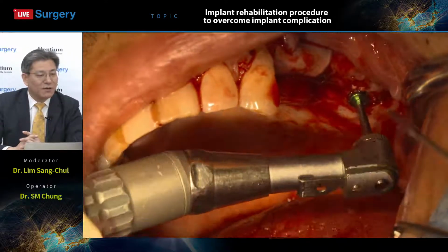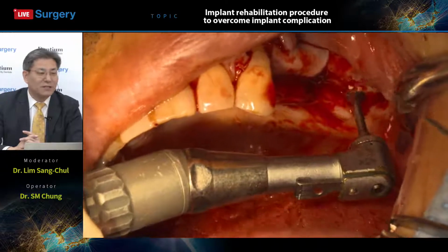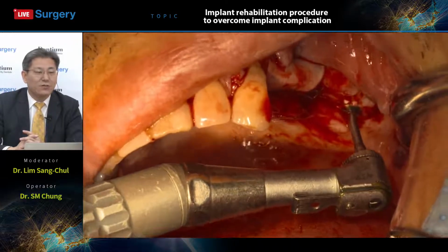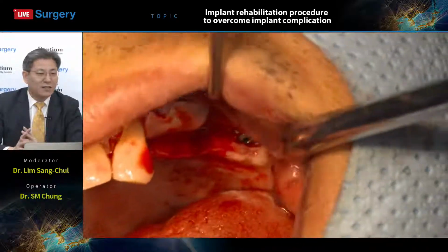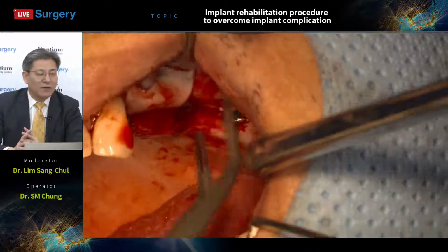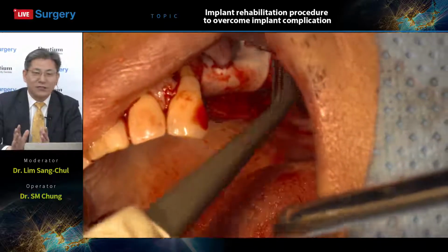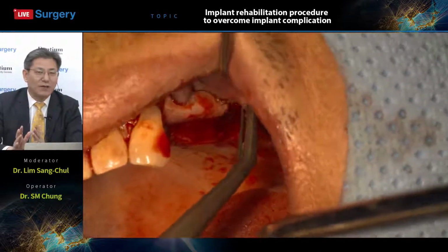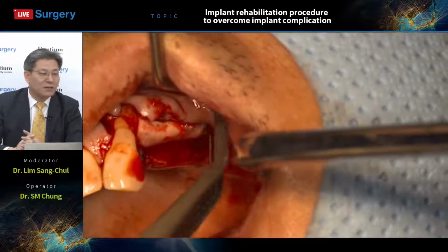This Bright bone level implant is very unique, with a different connection compared to Osstem. Osstem is an Astra type connection, right? 11 degree, but this Bright connection degree is 10 degree. 10 is Dentium style, Dentium type, right?